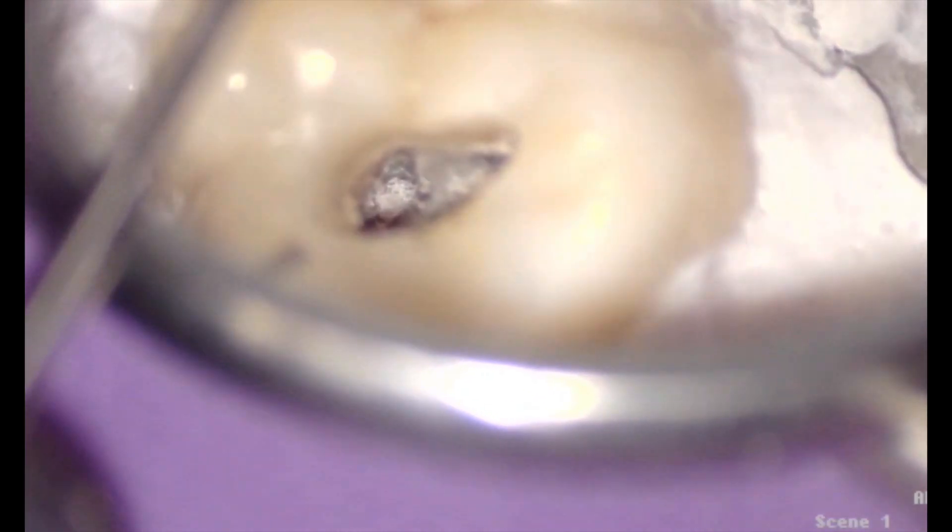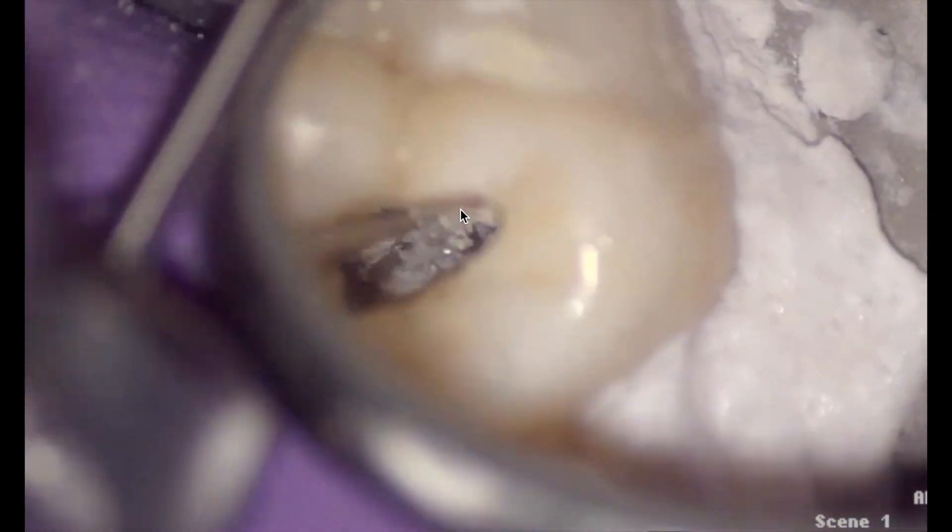The next tip for calcified orifices is to look for the white dot or the white line. There's a lot of white dots going on here, but this one seems to be it — you'll see it in just a second. Meanwhile, my dental assistant Dana is just blowing air right into the pulp chamber. Write in the comments below — I'm interested to know whether we should start fabricating these Muntz burrs. They're available in the United States, but if you're elsewhere in the world you might not have access.